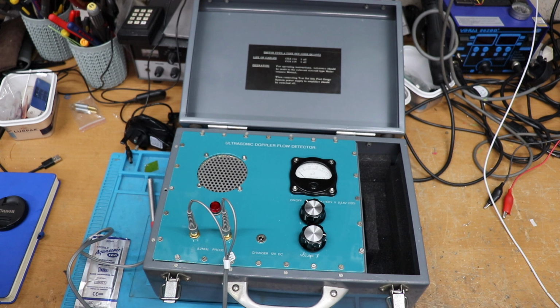And the other thing that you use these machines for, which is the more common use, is for measuring the pressure in the circulation or in the blood vessels of the legs. What you would normally do is put a blood pressure cuff around the ankle, and then using this Doppler machine you would detect the Doppler signals over, say, the ankle pulses, and then by pumping up the blood pressure cuff and seeing when the signals disappear and reappear, you can determine the perfusion pressure in the foot. We call that the ankle brachial pressures, or ankle brachial pressure index, when you compare it to the blood pressure in the arm. So that's quite a common way of assessing circulation in vascular patients.